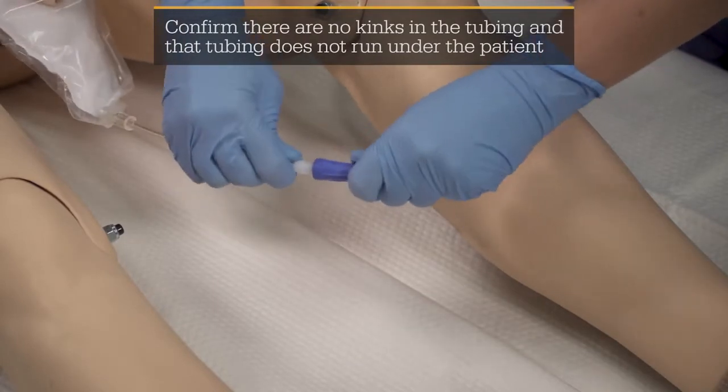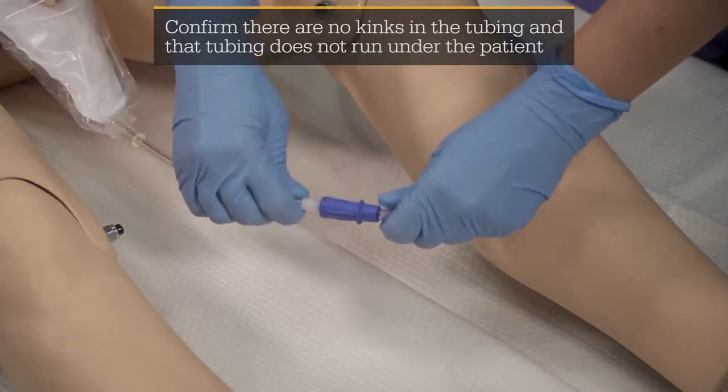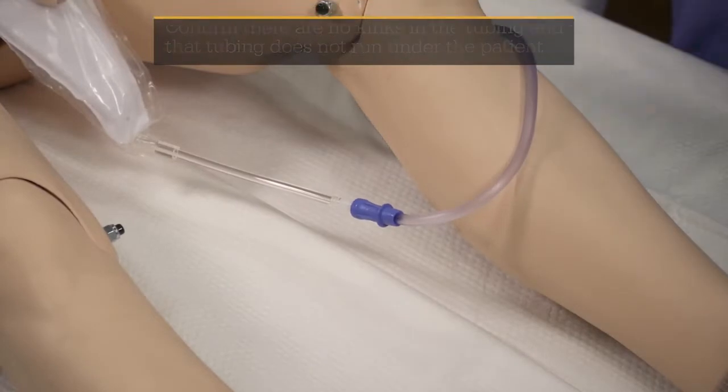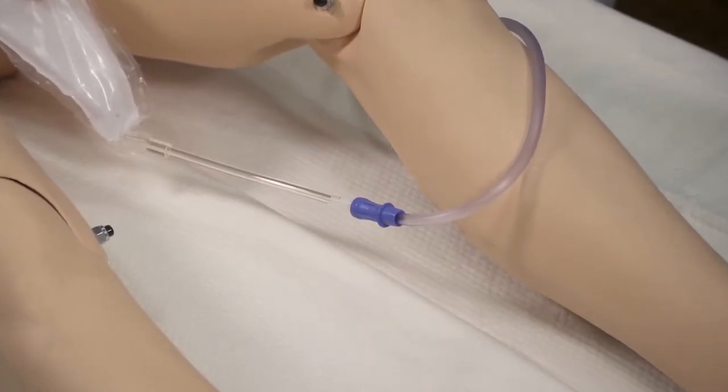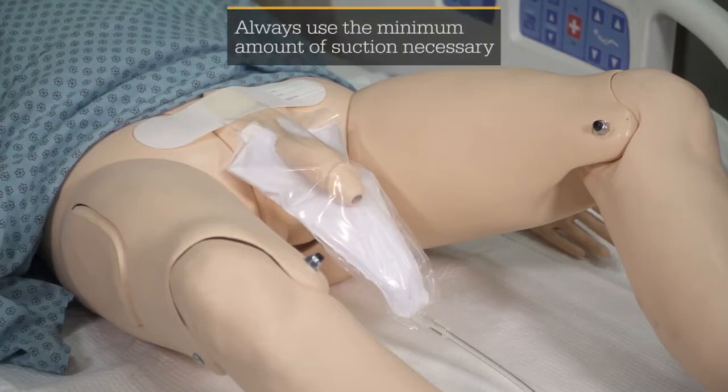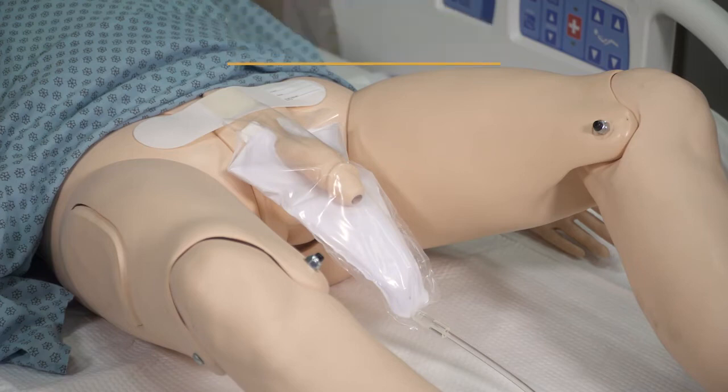Adhere the adhesive pad onto the patient's abdomen. Attach suction tubing to the device at the suction tubing adapter. Ensure the connection of suction tubing to the device is secure and connected at all times while the device is in use. Secure the tubing per your hospital's protocol. Set the vacuum to low continuous suction at a minimum of 40 millimeters of mercury.